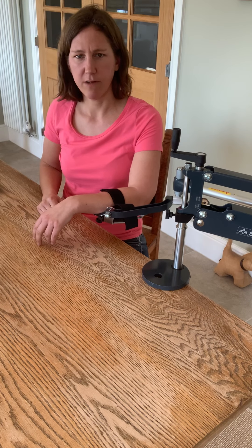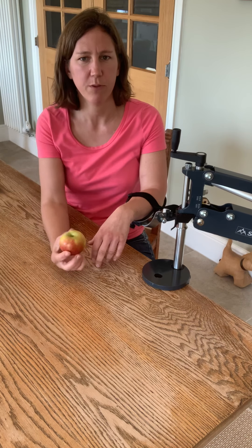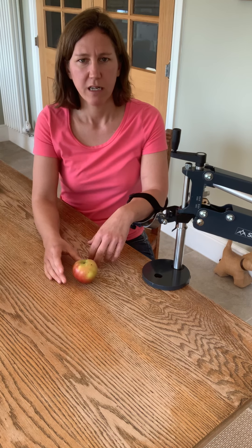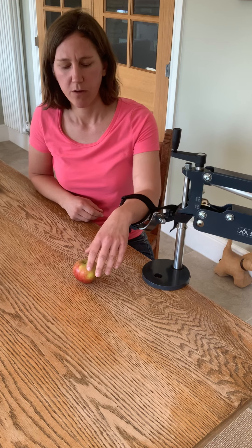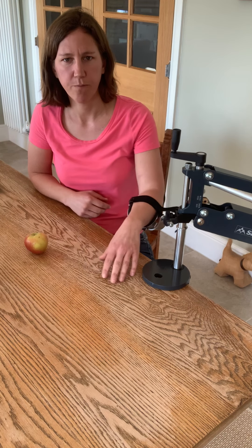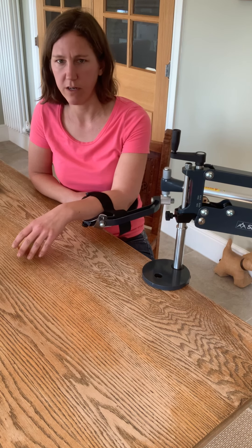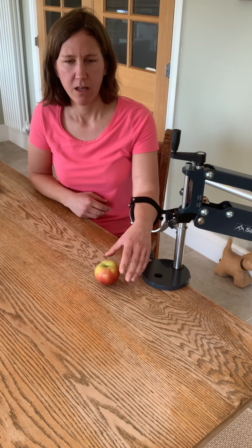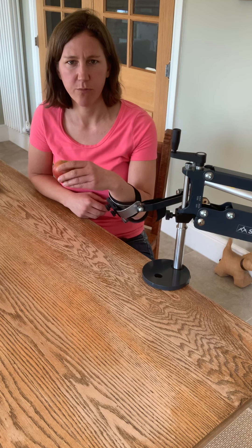Now my arm is nicely floating. For different tasks you could start with — I've got an apple here, but it could be a tennis ball or a smaller object — just craning your arm over the top, bringing your arm down over the object, picking it up and moving it from A to B. Coming back again, trying to crane that arm over, picking it up and moving it A to B.